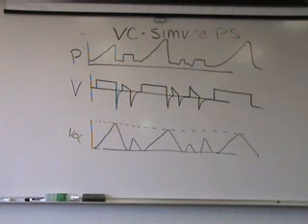In layman's terms, volume controlled SIMV is I set a rate, I set a tidal volume. If the patient breathes over the set rate, they can do spontaneous breathing. Those spontaneous breaths can be augmented with pressure support. And the SIMV breaths try to synchronize with the patient's spontaneous efforts.